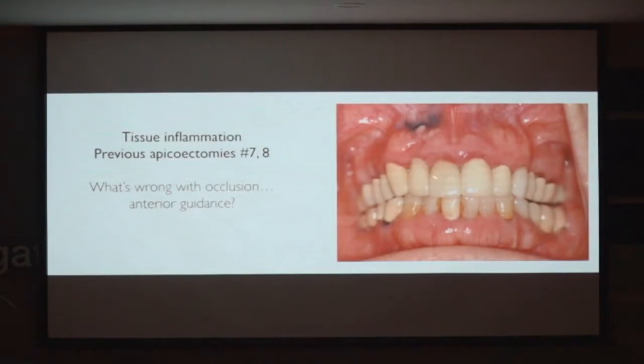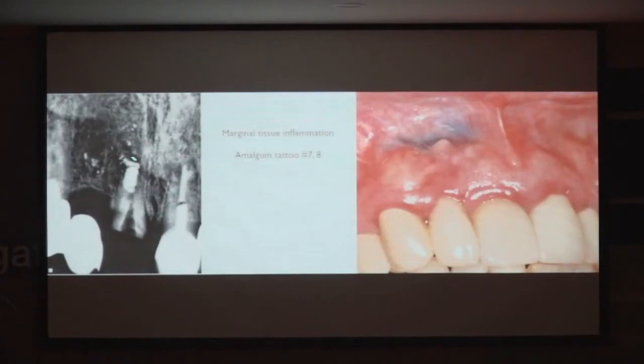Now, why did this tooth fracture? This is proclined a bit, and that tooth caused fracture of that. So that bottom tooth has to be addressed. So let's look at the x-ray. This is the apical that's on this tooth. But all this tissue is burned out a little bit on this periapical. When I probe in here, I can feel the bone, but look at the inflammation here around this. It's got a little bit of a pseudo pocket. It probes around 3.5, 4 millimeters.